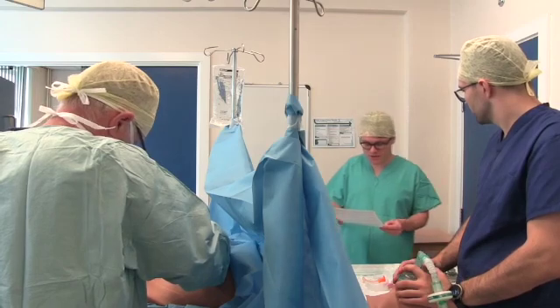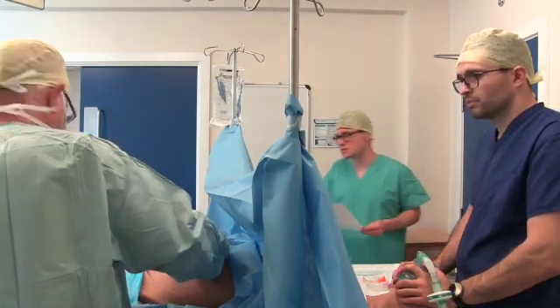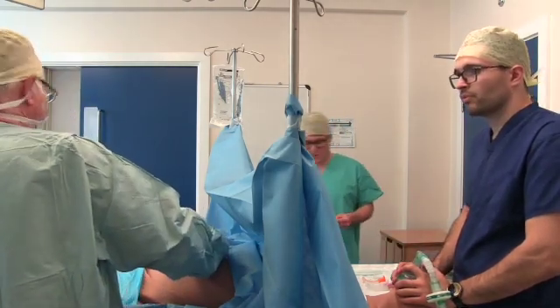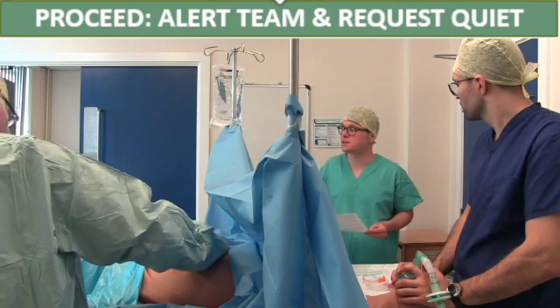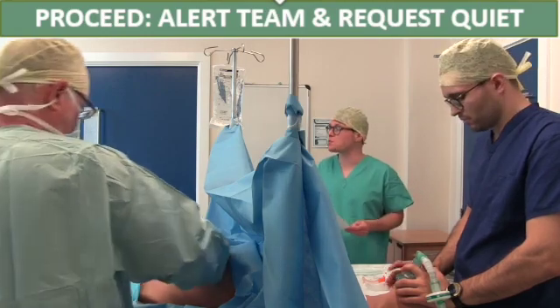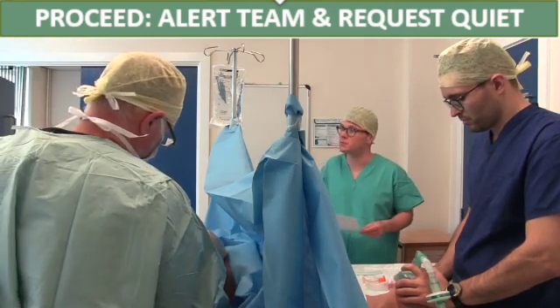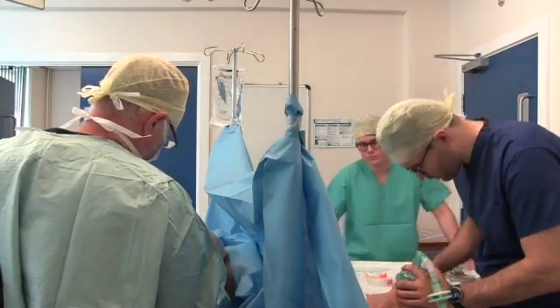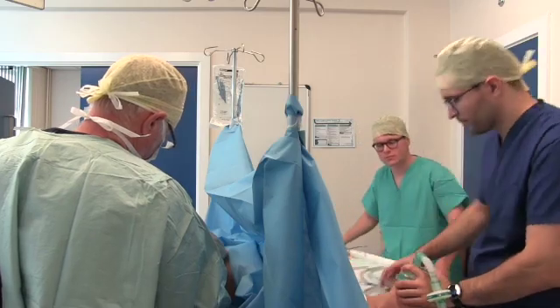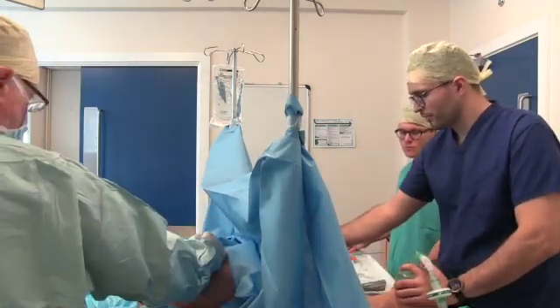Okay, so we're happy with the checks. I'm happy with all my equipment. Surgeons have finished prepping, so I think we're about to proceed. Could everyone in the room be quiet, please? We're about to proceed with the intubation. Okay Rachel, we're just going to drift off to sleep now, okay? We're going to take really good care of you.